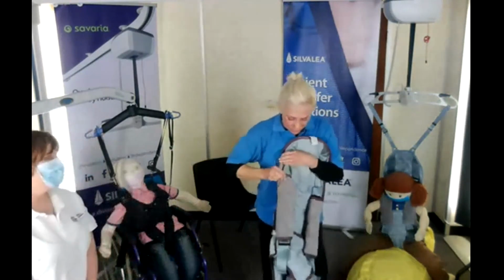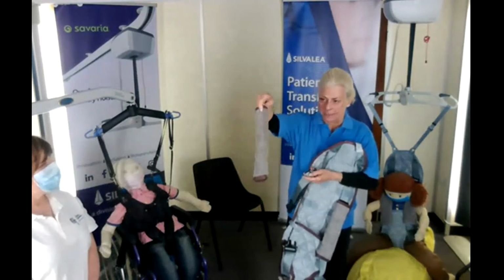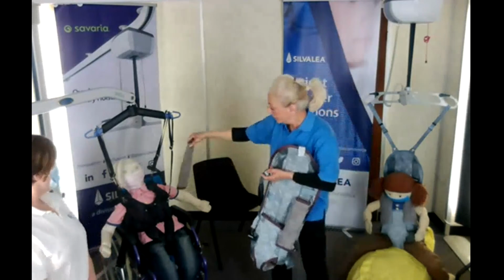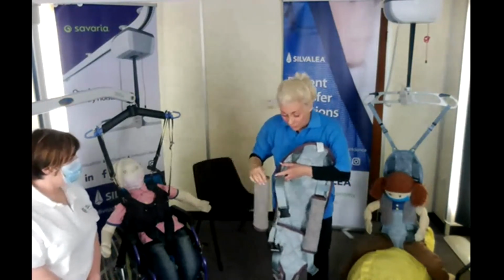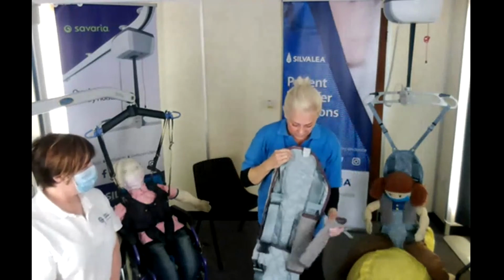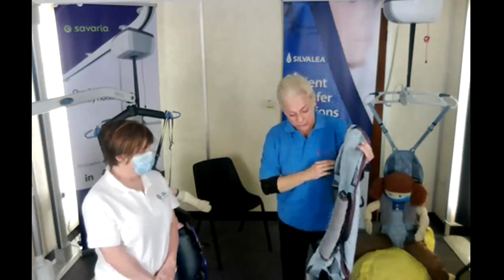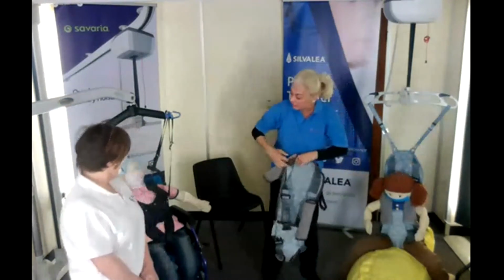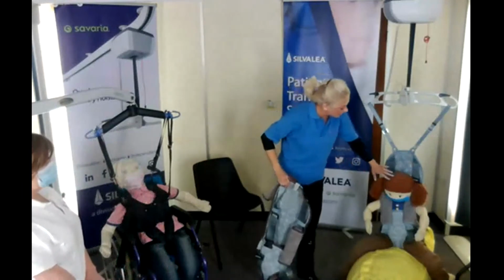So yes, they would look like this. Show you. This is a little plastic toweling sleeve that would go over. It would just Velcro around, so that's an option. But with this one, there's a few more benefits because of the back and head support. You've also not got tapes that are coming in front of the face like here. So that is a really good plus.